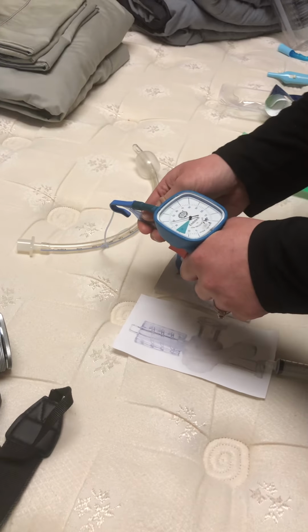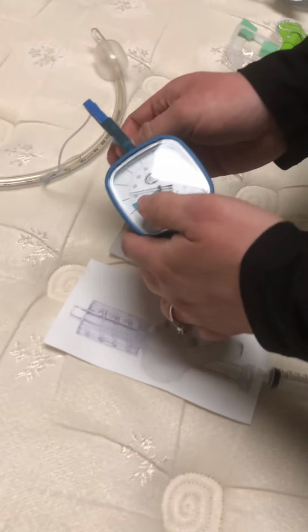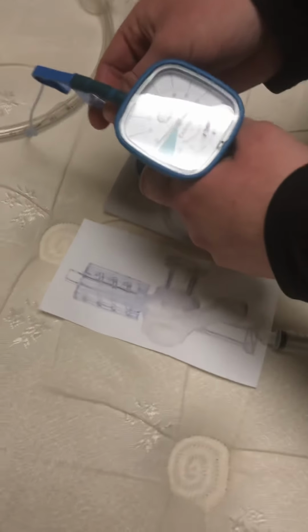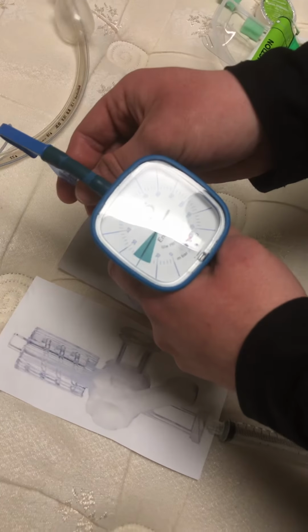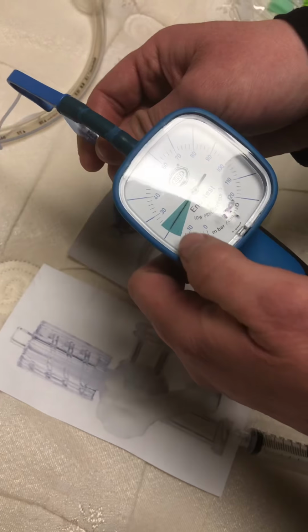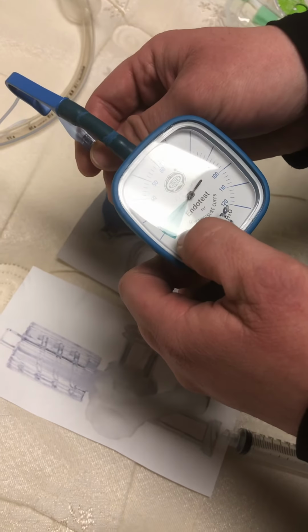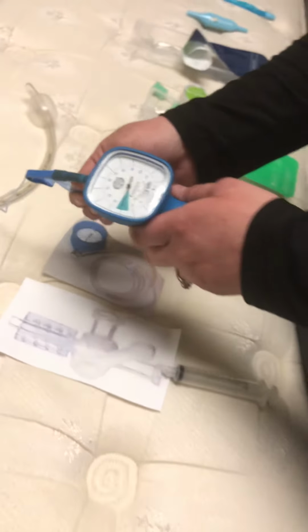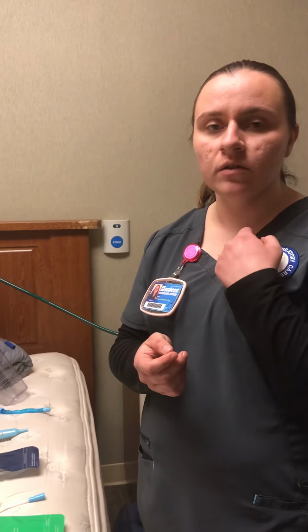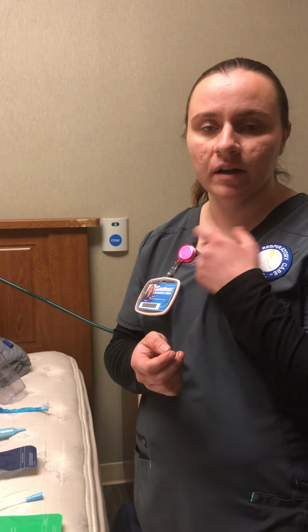So if it's up too high above your green, what you're going to do is take your red button here, and you're just going to slowly release that pressure like that. And so you want to have it in the green, so that way you know that pressure cuff is not too inflated to where it's going to cause any sores or irritation to the patient, and that way you know it's not too low of a pressure to where they may aspirate anything like that.